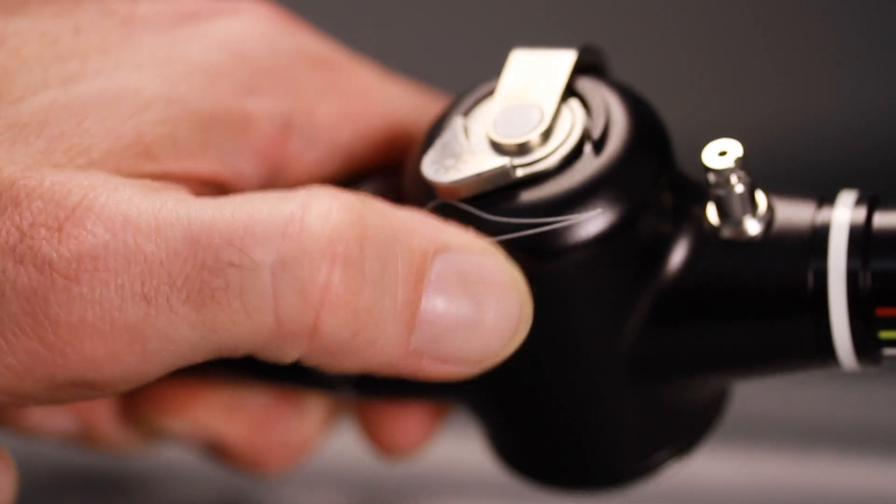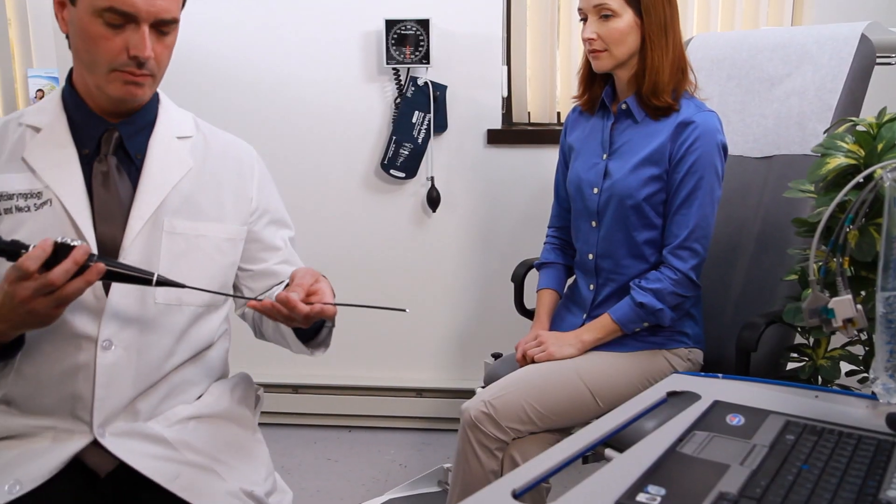By giving you freedom of movement, you can take the scope to the patient wherever they are. That means you can perform more exams in a day, with the ability to scope each and every patient as needed.